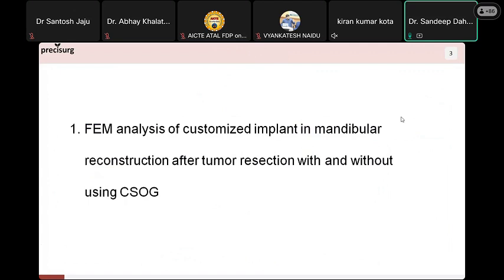In the first month, the implant was as it is. Second also not changed. In the 6 months result, it is again not that much change, but some prominent change has been shown after 24 months. But otherwise, the implant is playing its role properly.